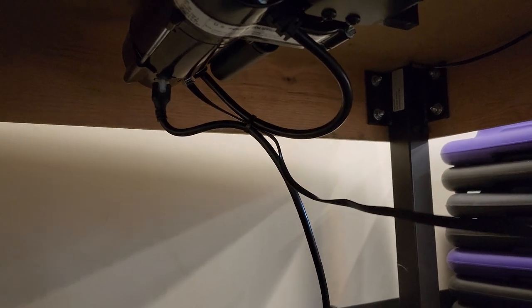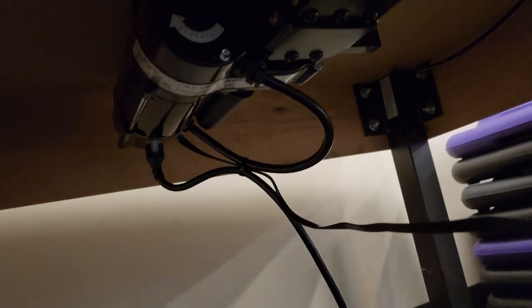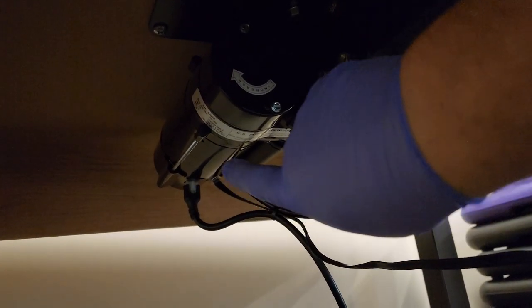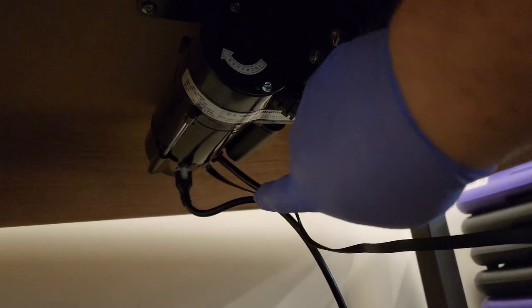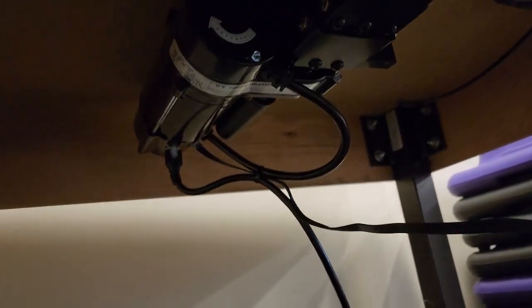So one of the other things I want to show you guys is there is a power cord, and you can see how it plugs into the motor controller at the end of the motor, and then it goes to the wall. Well, that is just a Molex type connector. So you can see what I did is there is one hard wire right here that comes from here to the motor. And since it's a hardwired connection, it's going to be the most stable. And I zip tied the power cord, and also this right here is the activation button. They're all zip tied together so that nothing is pulling on those ports. So even if the power cord gets yanked or tripped on, it's going to pull on this guy instead of on the motor.